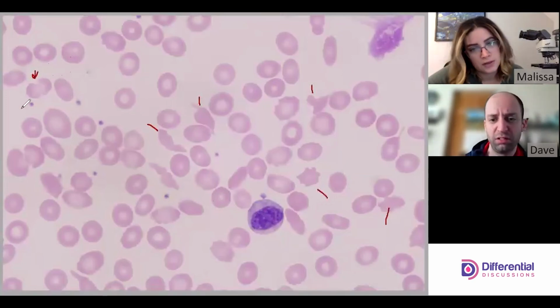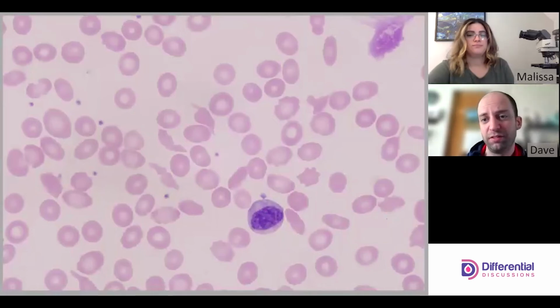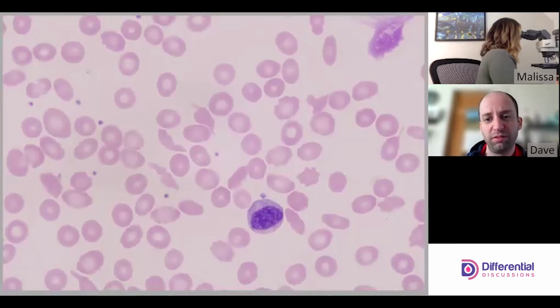I wonder... interesting, because it almost looks like these are little bites. It does. It does. What's going on? Nosy me. It's that curiosity.